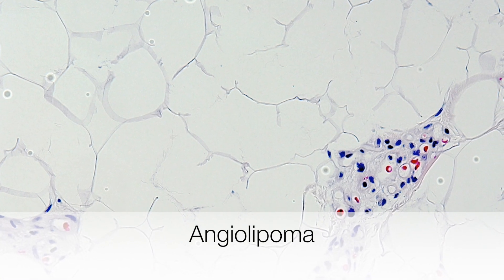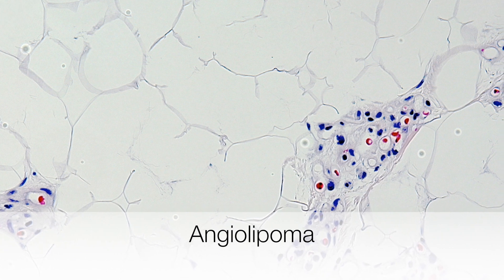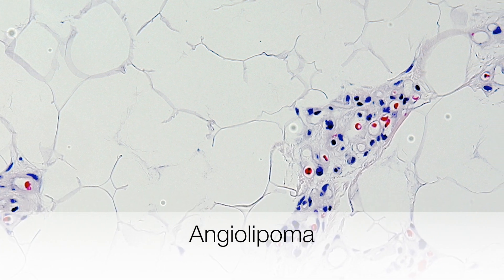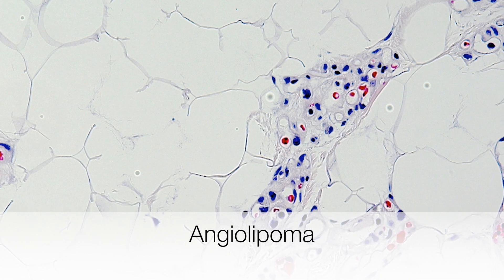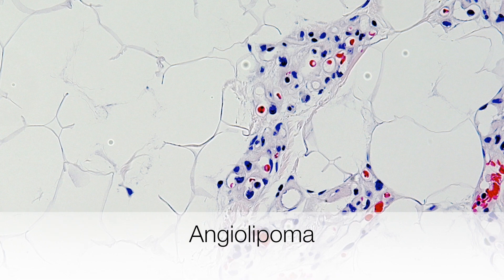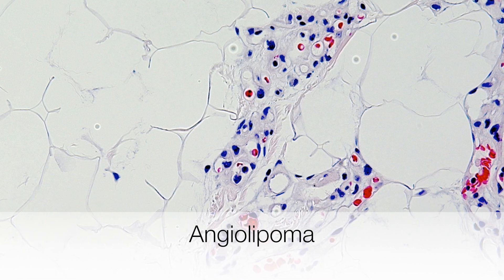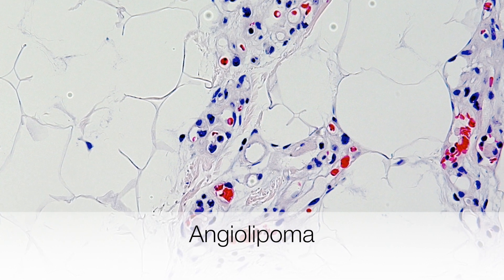This is a good example of an angiolipoma. On the left side of the picture is the mature adipose tissue, and on the right side of the picture is the vascular component.